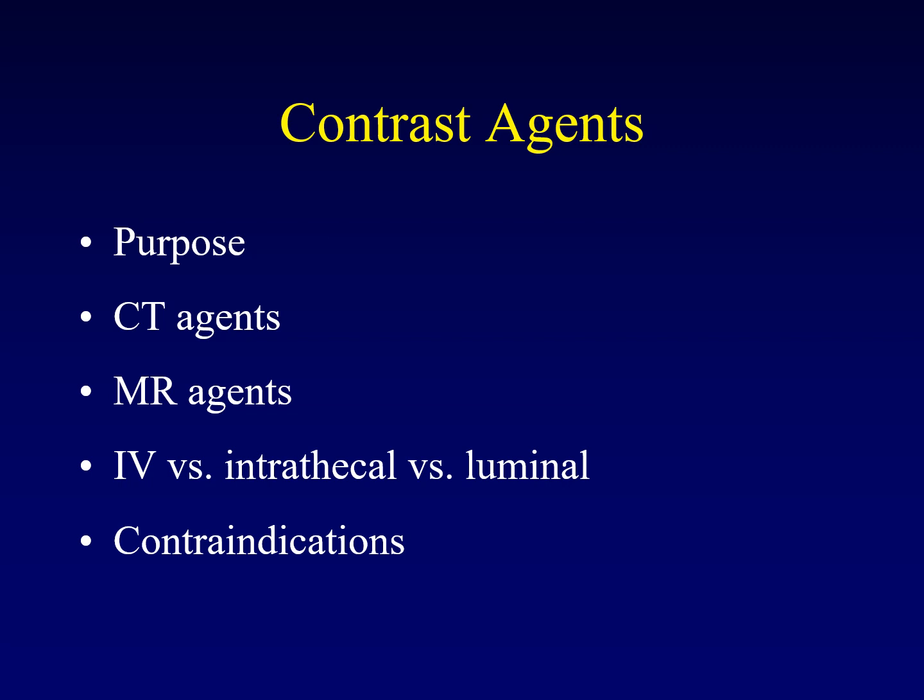When we're talking about CT, CAT scans, we use iodinated contrast. Iodine does a particularly good job of blocking X-rays at the energies that we are using for imaging. So if we add iodine, and we're not just injecting free iodine, it's encapsulated in an organic molecule, but if we add iodine to the bloodstream, that will block the X-rays and it will be bright on a CT.